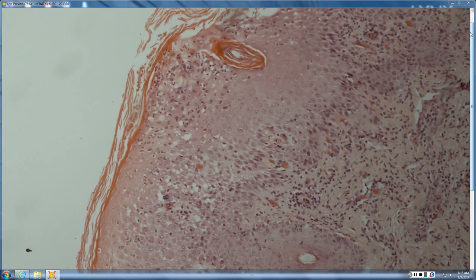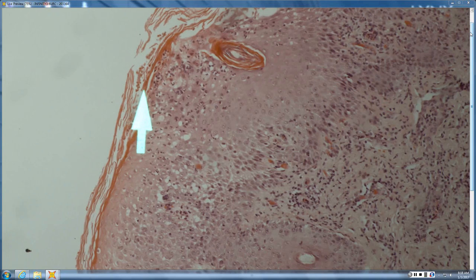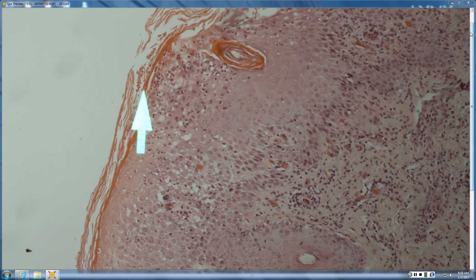Absolutely. And of those, which one is most likely to give you a layered corneum where you have normal lamellar corneum sitting on top of compact red? Is that fungal? That's good. That's a Majocchi. And then these little circles here in the compact red are where you're seeing a couple of hyphae. So that's all clues to fungal folliculitis.